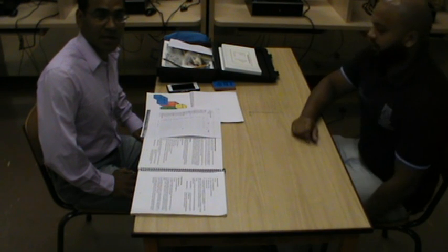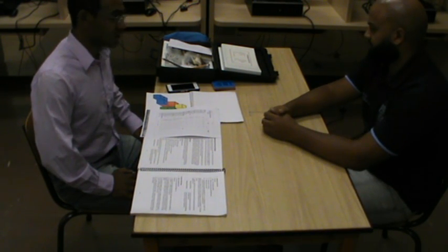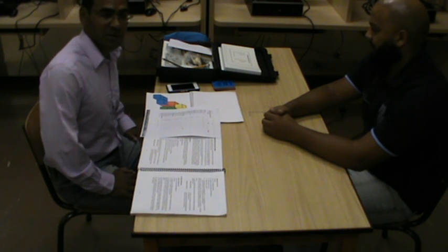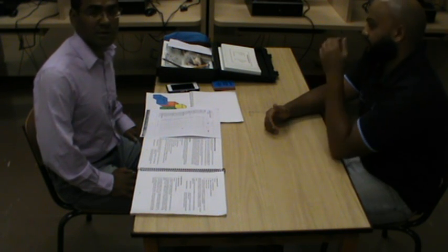Today we're going to demonstrate how to use the LOTCA test. The LOTCA test was originated in Israel, specifically with clients diagnosed with stroke as well as traumatic brain injury.